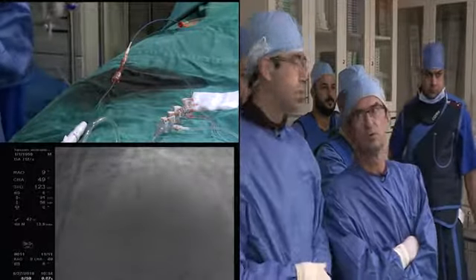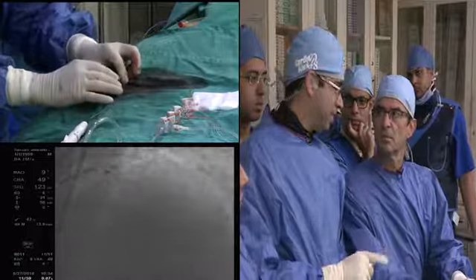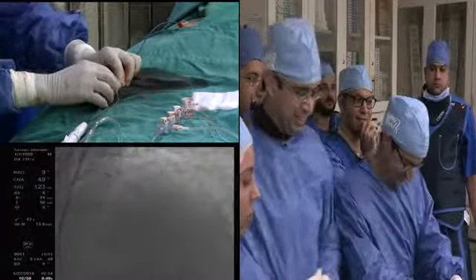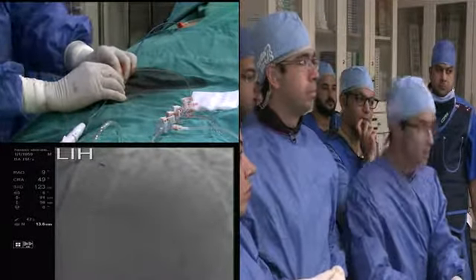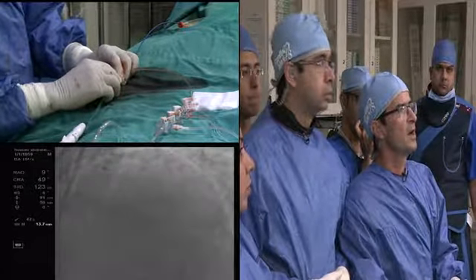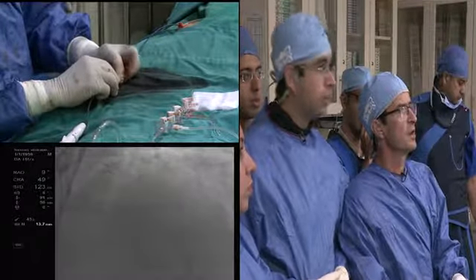Do you want to put IVUS? Yeah, for future purposes, to make a discussion. Okay. I go down with Mohamed and Antonio. I am going out because I think it is enough. So I'll put a rota glide to get out.